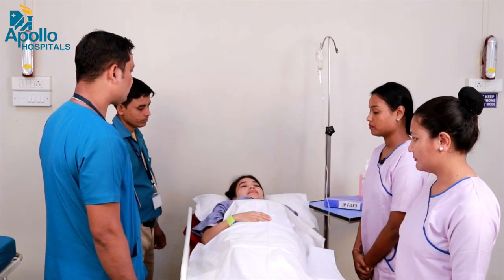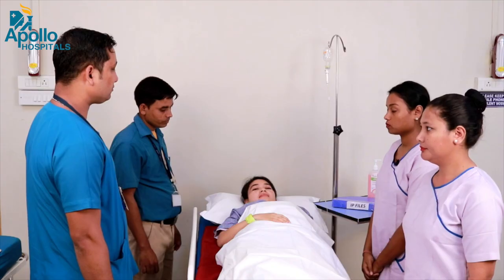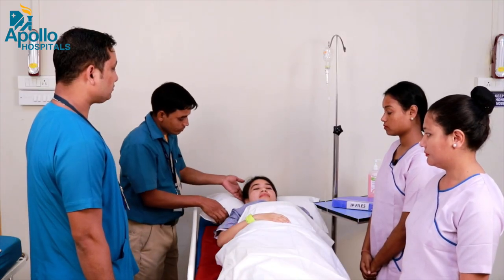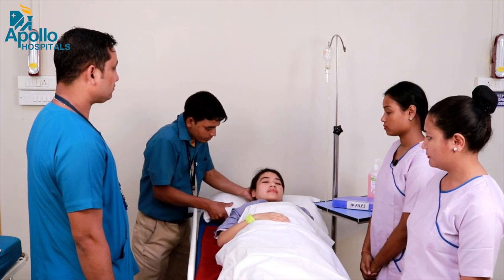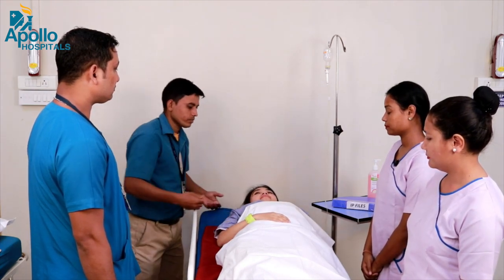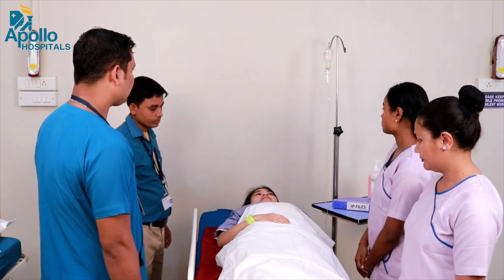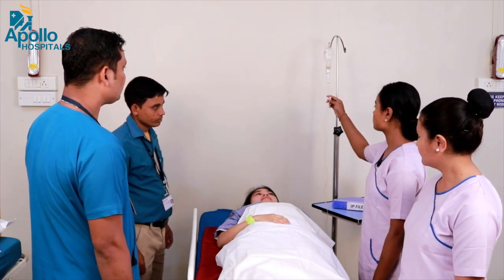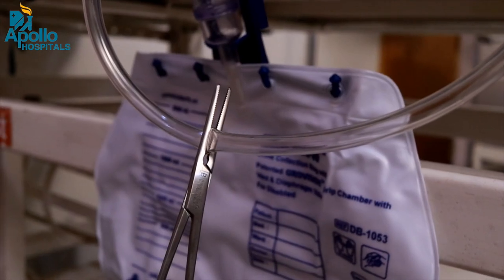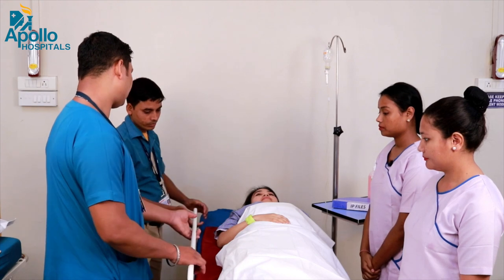Make sure bed brakes are locked. Support the patient's head while you remove the pillow. Ensure all lines and drains are clamped to avoid dislodgement. Remove the side rails on the back.